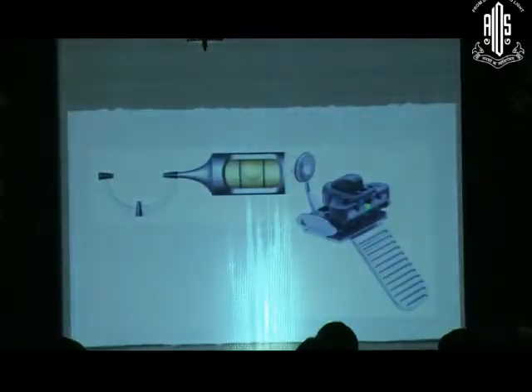Once you have the chart showing that you have to implant the particular IOL at this steep axis, first we mark the reference axis on the cornea, that is the 0 and 180 degrees. There are various instruments which can be used to mark. This is the ASICO bubble marker. It has a bubble in between, and these 3 prongs. You put the ink on this prong, and the bubble marker tells you whether you are at the perfect horizontal level or not. So you can mark the 0, 180 and the 6 o'clock.